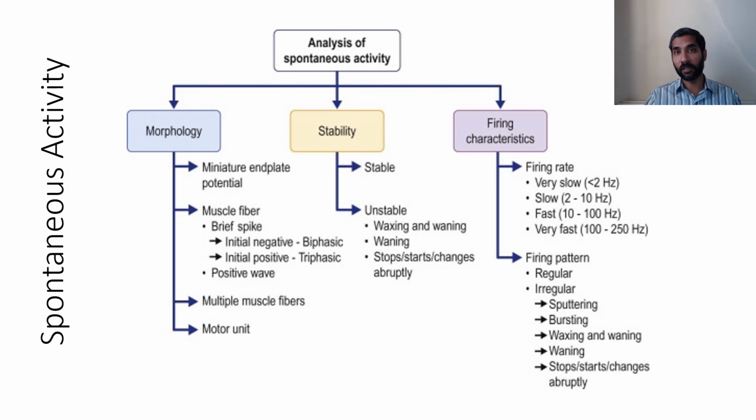Okay. One interesting thing about this is that when clinicians actually use needle EMG, one way you look at the signals is on the computer screen, of course. But many clinicians also convert these motor unit action potentials that you're recording into audio. And as you get more and more trained, just listening to the audio, you can say, well, the action potentials are not very regular or irregular, or their shape is slightly different. I think there's something odd about it. Or, you just develop that skill of deciphering motor unit action potentials just from the sound that they produce.